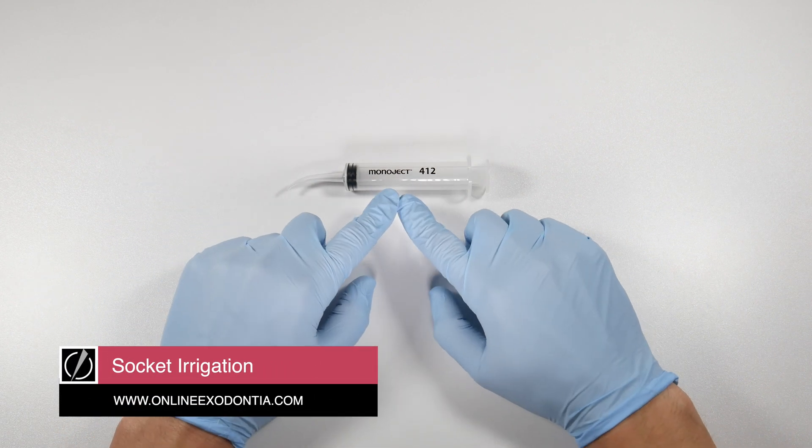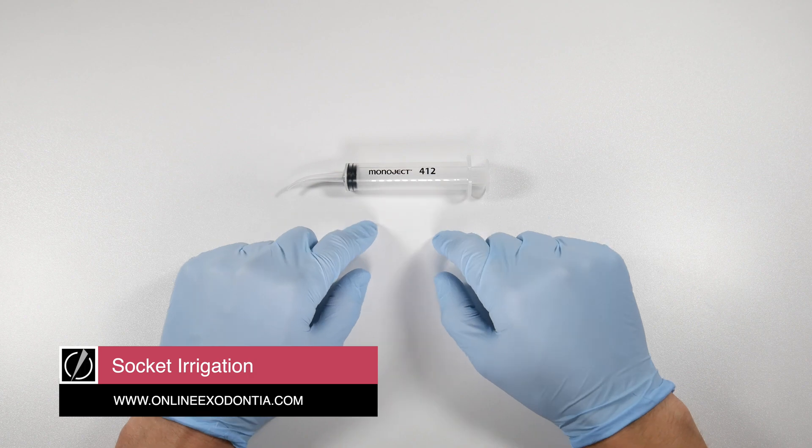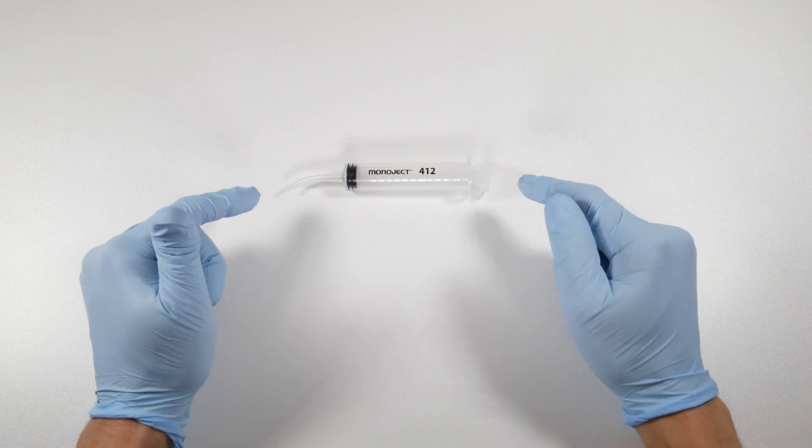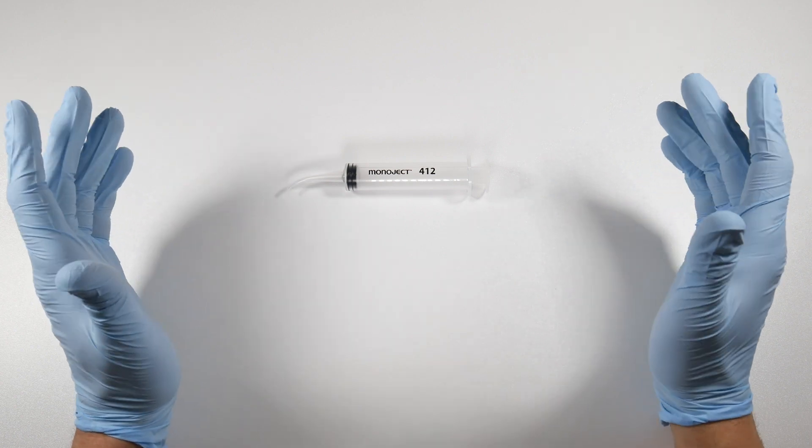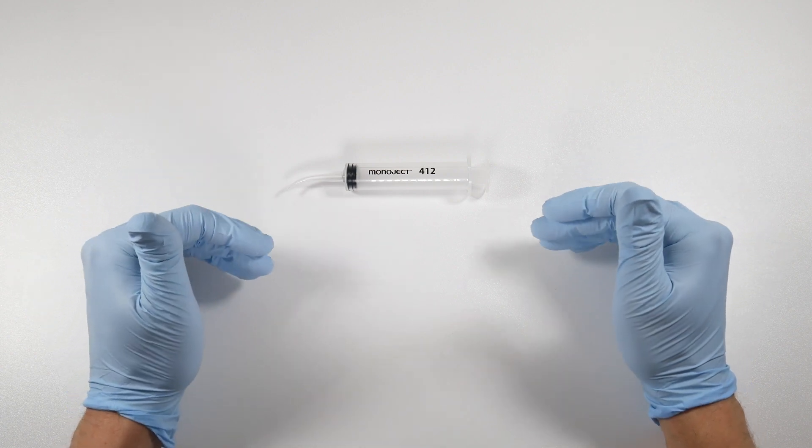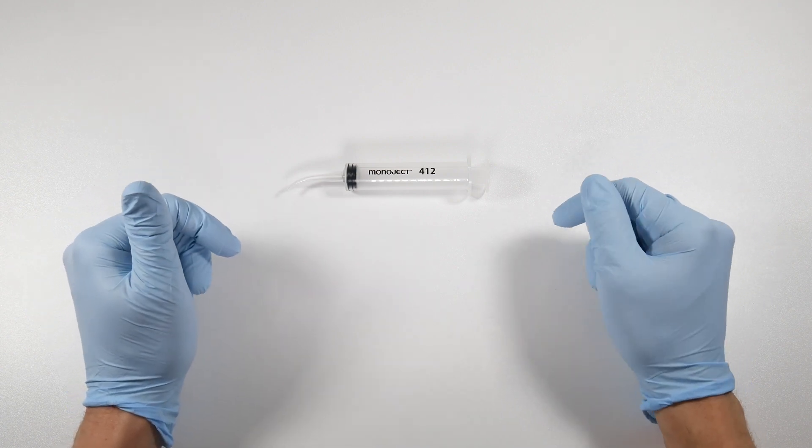In this video we're going to talk about the Monoject 412 syringe. This is what we carry in our office. I assume that most of you have had some exposure to these or have them in your practice. If not, you really want to make sure that you look at getting some of these because they have great uses and they're handy items to have around.